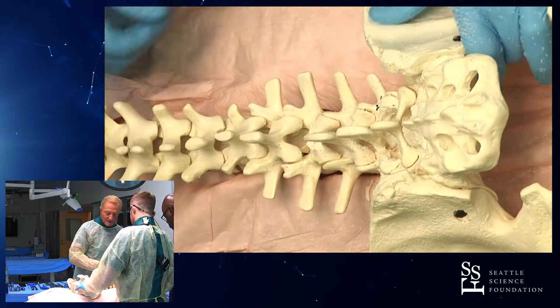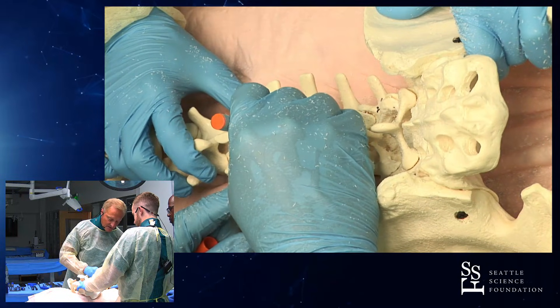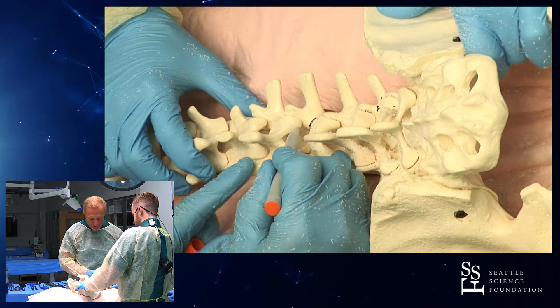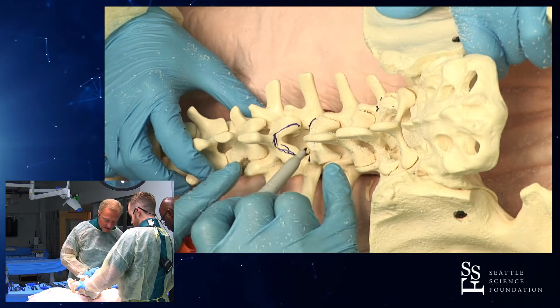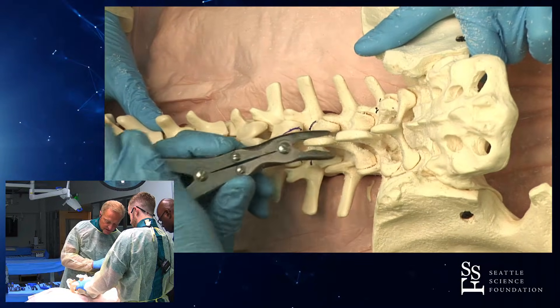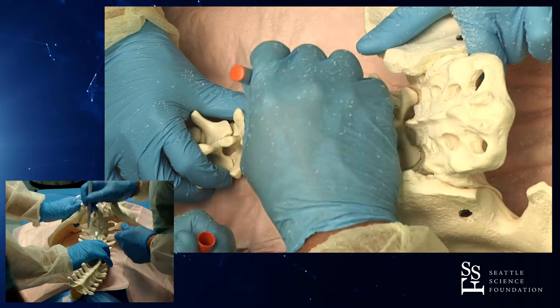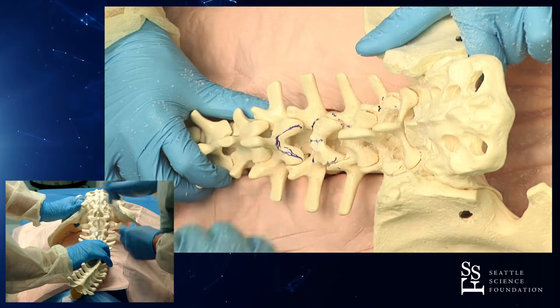What are we going to do here? This allows us a full laminectomy. We're going to do a T-cut: vertical along the interspinous line, and horizontally, or semi-horizontal, through the pars interarticularis. To carve this out then, we'll do a lazy C-cut — a C laying down like this — and we'll nibble off this next lower spinous process, because we've decided we'll do an osteotomy. We're going to complete that then with a W-cut. The W-cut will give us a full facetectomy.